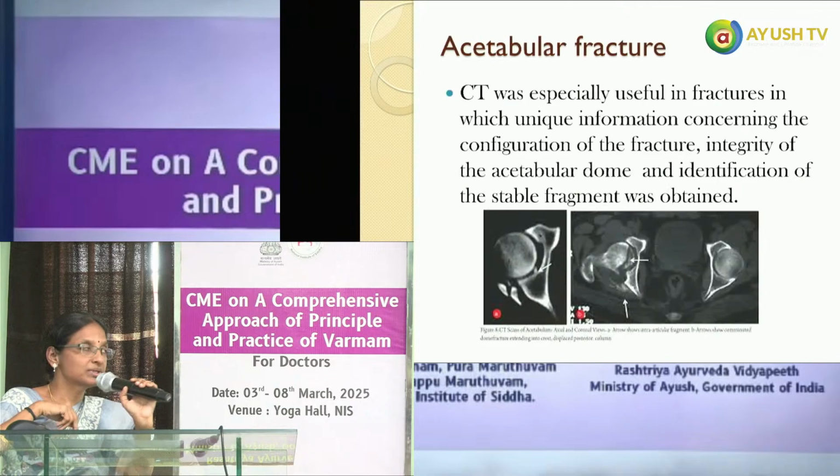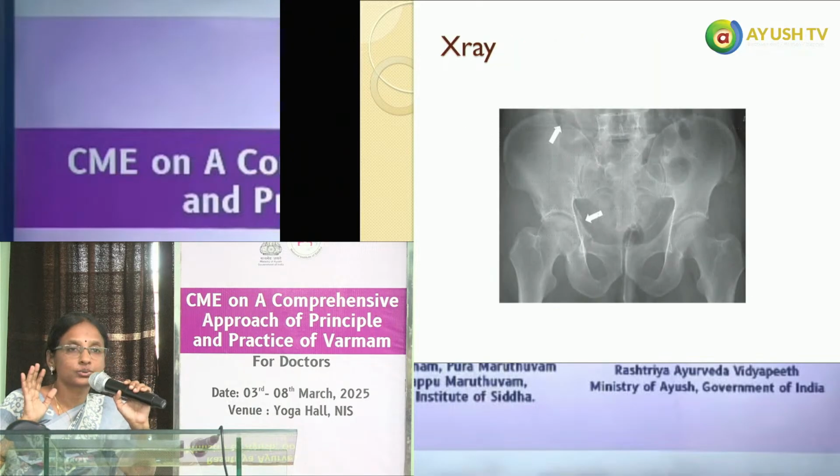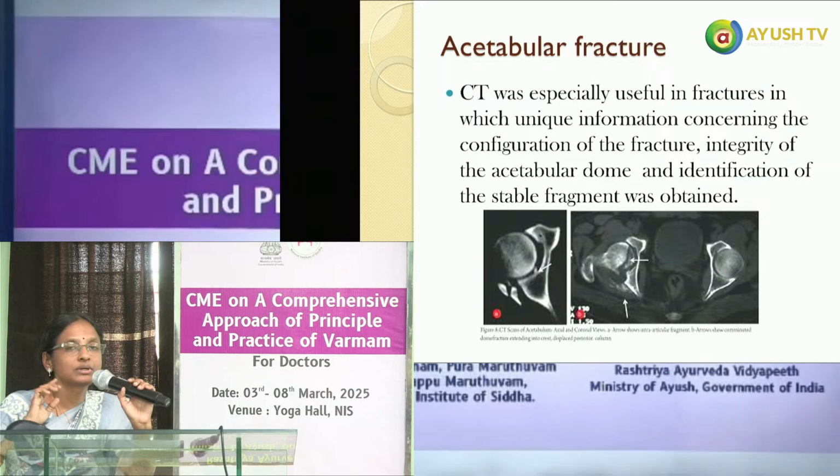And for that same patient, CT scan was done. And the first picture ல சின்னதா arrow point பண்ணிட்டு இருக்கிறது ஒரு குட்டி fragment. So that fragment has broken from the acetabulum and has come into the joint cavity. So intra-articular ஜாயிண்ட்டுக்குள்ளர ஒரு சின்ன fragment இருக்குங்கிறத the X-ray doesn't show us. இதில் வேறு எதுவுமே பிக் பண்ண information கிடைக்கல. So that is possible only with the CT scan.